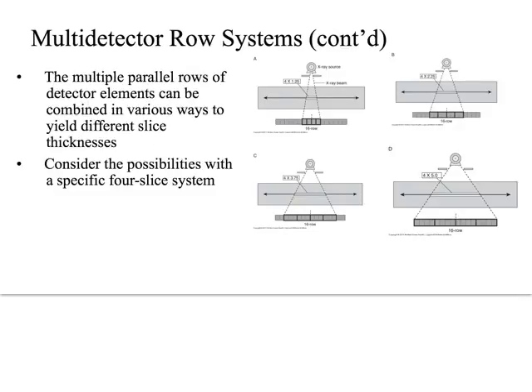Here's what that looks like. This is in our textbook in some detail on page 48. But I just want to point out that what this is doing is opening up that collimator further and further, and I believe this would be along both the x-axis and the z-axis. So it almost makes a cone-shaped or pyramid-shaped beam that is specific to the slice thickness that you want to scan.